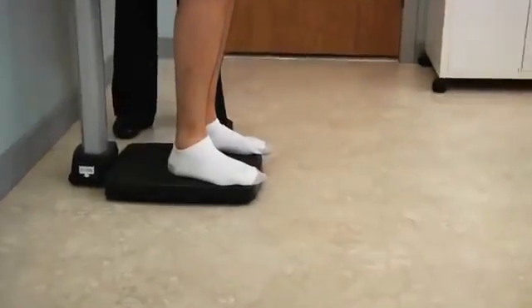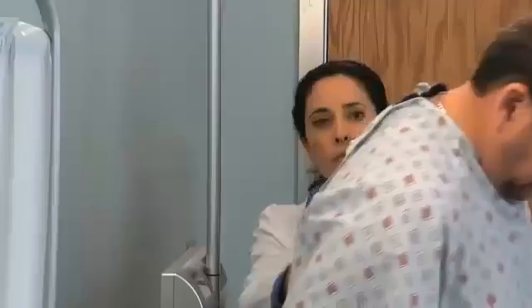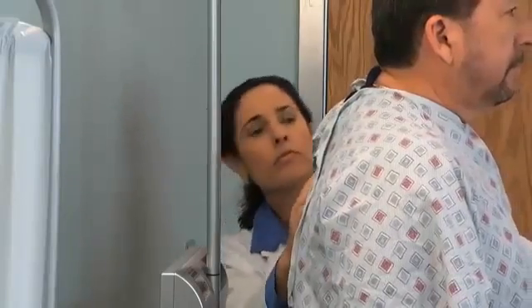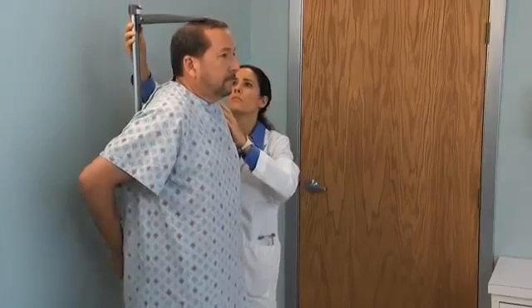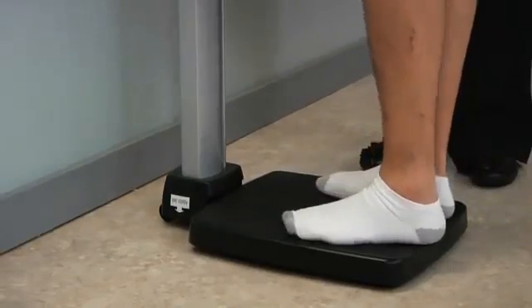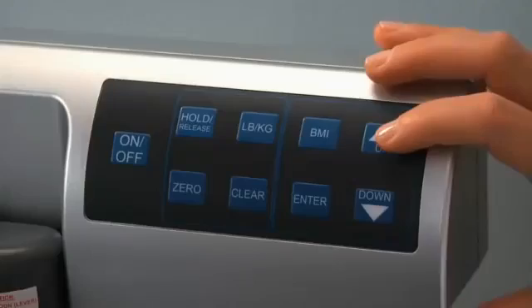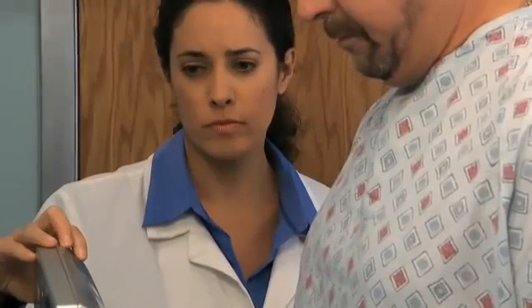If possible, measure the patient's height with the patient in stocking feet. Take this opportunity to note general body proportions and look for any deformities, such as kyphosis or scoliosis. Whenever possible, weigh your patients with their shoes off. Make note of any weight changes over time. Use your measurements of height and weight to determine the body mass index, or BMI.